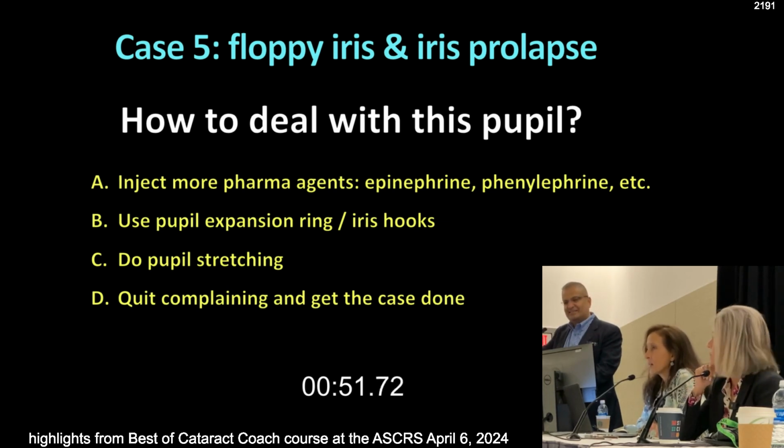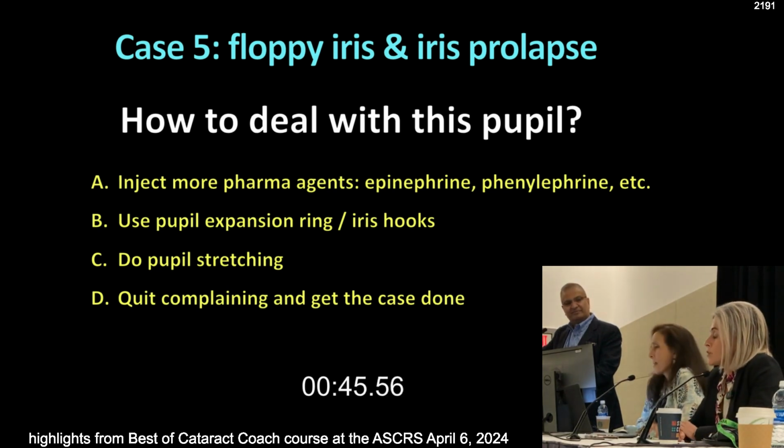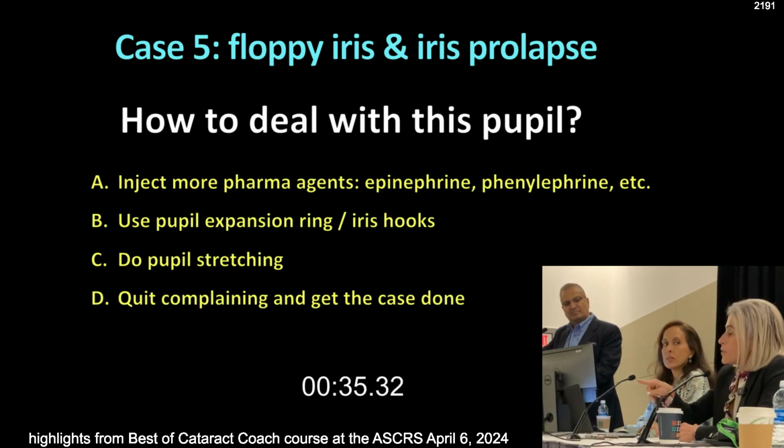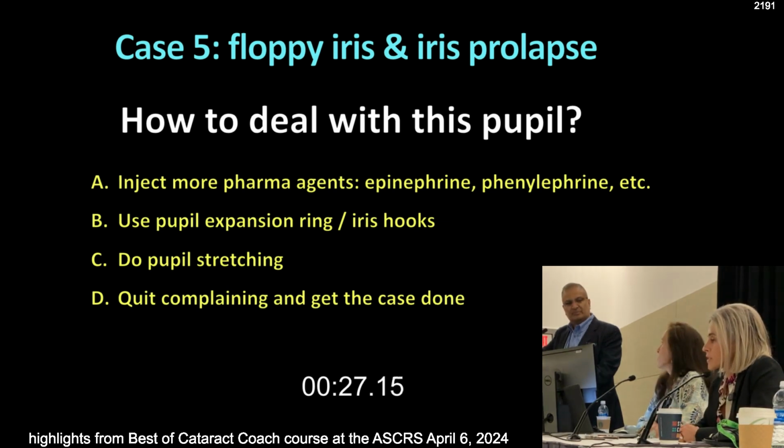Yes, you need a pupil expansion ring. For sure you do. 100%. What about hooks? I mean, you could use hooks. They just take more time to put in. So you could use hooks, and what's important is to do it as Tom Oeding described in the diamond configuration, with one hook underneath your main incision. So you pull the iris down and under, and you do it like that in a diamond. But I just find a pupil expansion ring just so much quicker to put in. I agree. Yeah, I do the same.